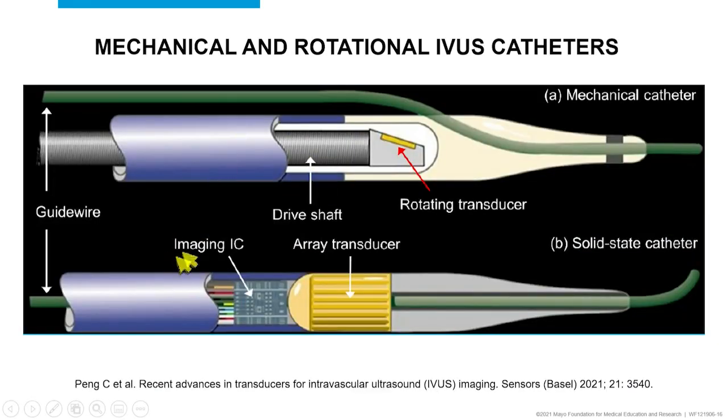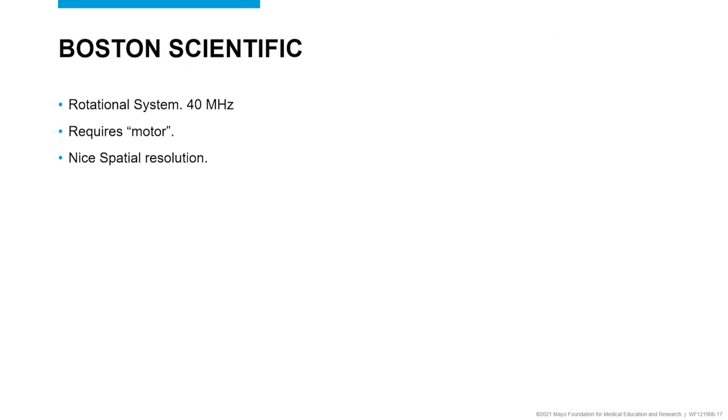The way these catheters work also affects the construction of these catheters. So if you look at rotational systems, because of the presence of the drive shaft, the monorail is typically very short. This becomes relevant because sometimes when you're trying to push these types of catheters around a tight angulation, they can prolapse because that monorail is relatively short, even though they're slightly lower profile compared with the stationary systems. In a stationary system, you've got a longer monorail, which gives you a little bit more pushability, but that sometimes is negated by the bulkier tip of the catheter. And I'm sure a lot of you have experienced with the use of both of those catheters have seen this.